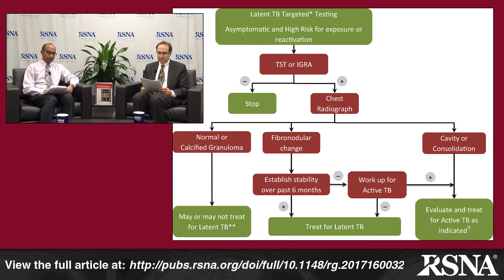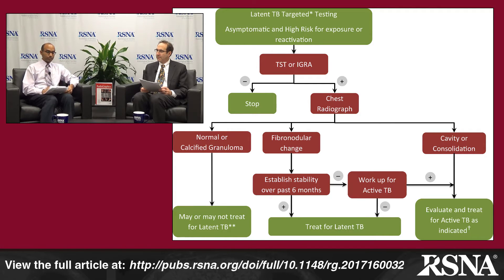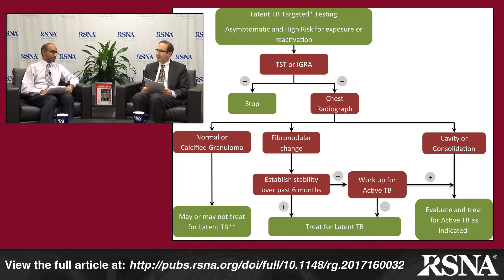The second leg is fibronodular changes. It's important to recognize these on radiograph — sometimes patients have biapical scarring that's minimal and symmetric, often attributed to ischemic changes. But if we detect asymmetry, more scarring on one side, or other evidence like hilar retraction and traction bronchiectasis, we should consider the possibility of inactive TB presenting with fibronodular changes. Once detected, we decide whether it's stable. If we have a comparison chest radiograph showing stability for six months, those patients are treated for latent TB with single-drug therapy.